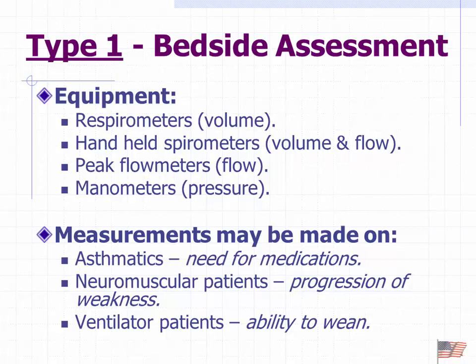That is something we'll use with asthmatics frequently, and I think probably covered that before. We looked at determining the zones of peak flow, whether it's in the green area with yellow or red. Actually, the other way around, green, yellow, red. And then we'll also use a manometer to measure pressure changes, for the maximal inspiratory and maximal expiratory pressure.